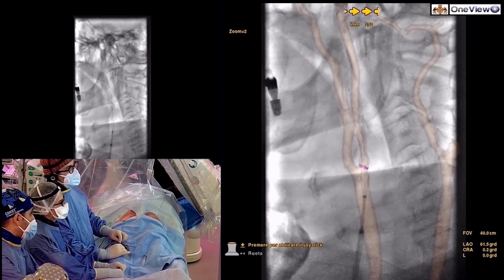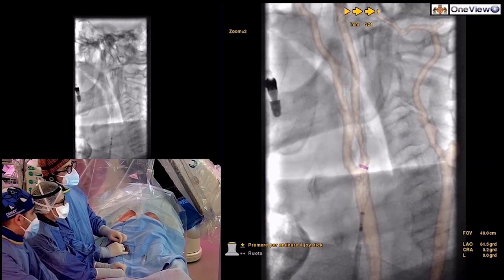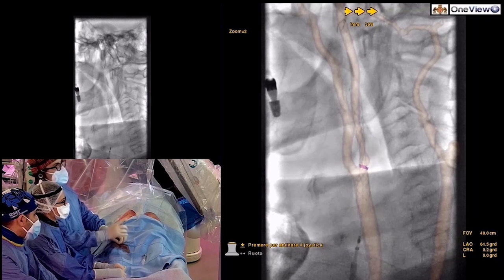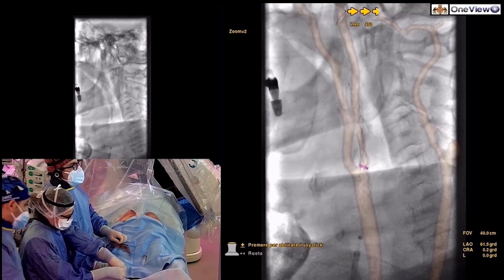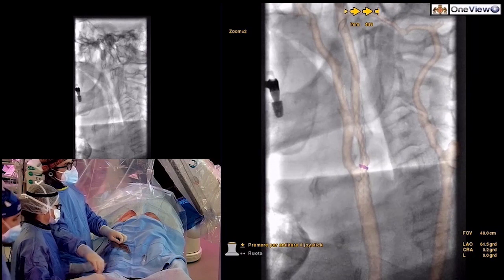You see, and this is something that is always important to prevent, is to avoid opening the stent rapidly, just to prevent any damage against the wall of the common carotid artery itself. Now we're retrieving the delivery system, and again we can once more perform a single shot.